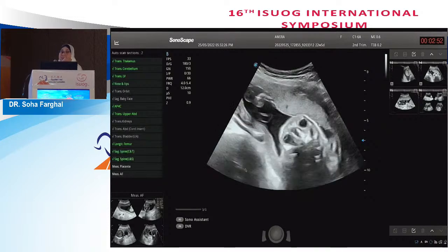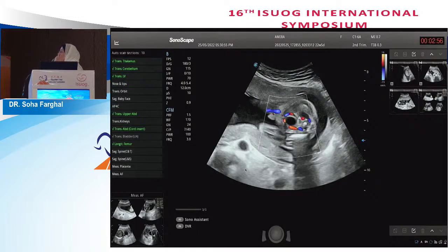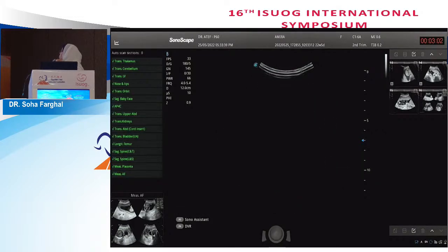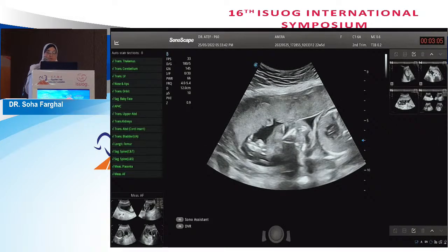Because if we are not 100% satisfied, we can remeasure or retake the view. Now all finished in 3 minutes and 2 seconds. Thank you. Thank you very much.